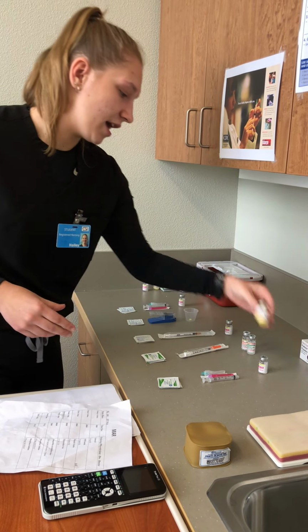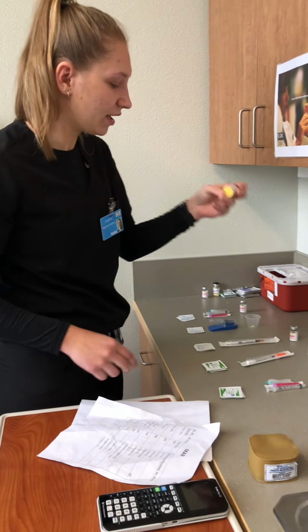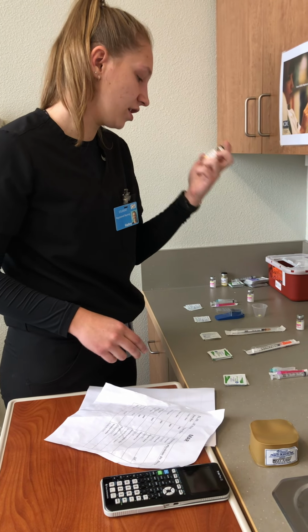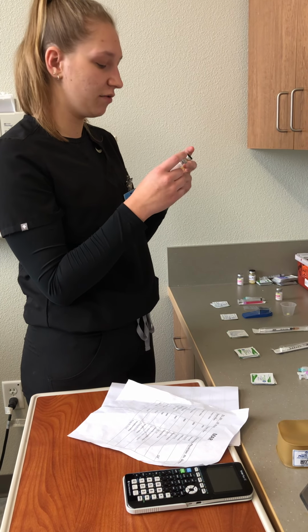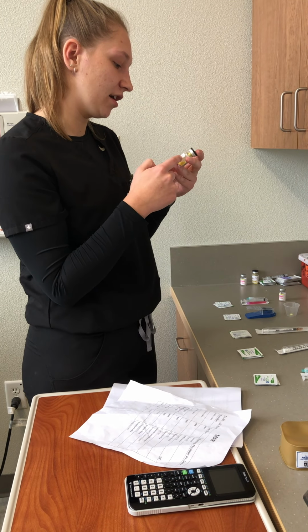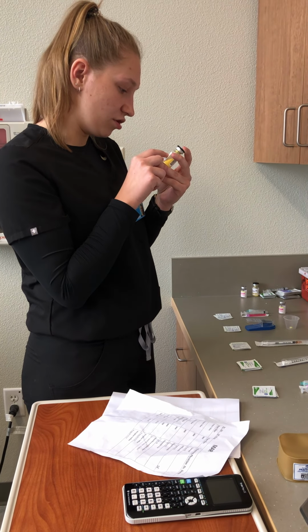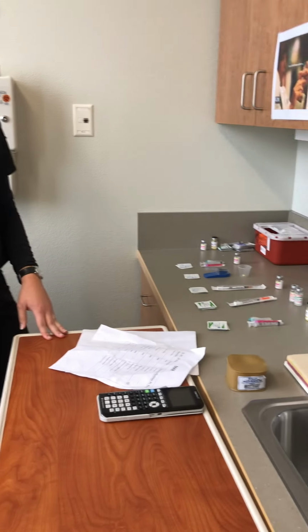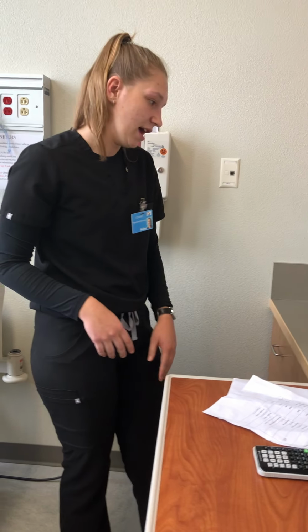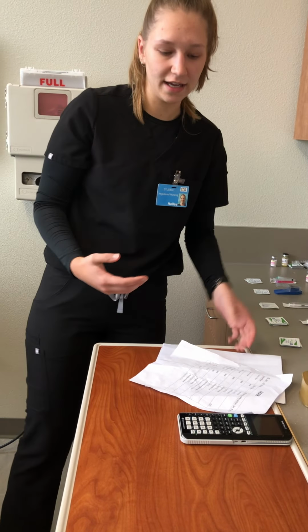And then I have my ampicillin powder that I pulled up, and the expiration date is also good on this. And I have my 5 milliliters of distilled water to reconstitute it with. And looking here at the powder vial, I know I have to reconstitute this with 2.5 milliliters when I get to that. So I went ahead and I completed my first check, and now I'm going to bring in all of the supplies and everything, and I'm going to go ahead and enter the room.